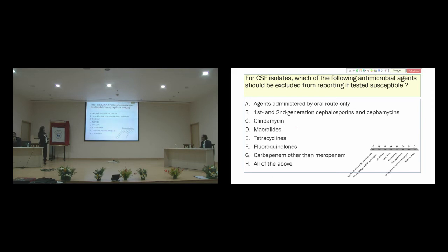Okay, so what is the answer? Few of them have answered. The answer is all of the above. These are the drugs which should not be reported for CSF isolates: agents administered only through the oral route, first and second generation cephalosporins and cefamycins, clindamycin, macrolides, tetracyclines, fluoroquinolones, carbapenems other than meropenem.